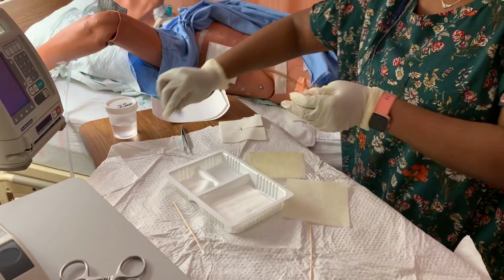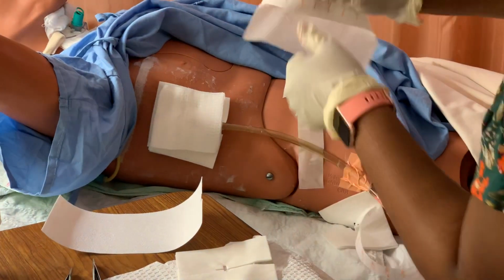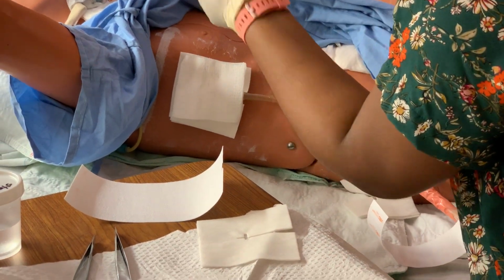Okay, so that's done. So I'm gonna put a cloth tape on there to make sure it's fully occlusive.